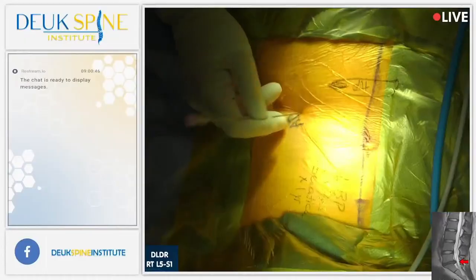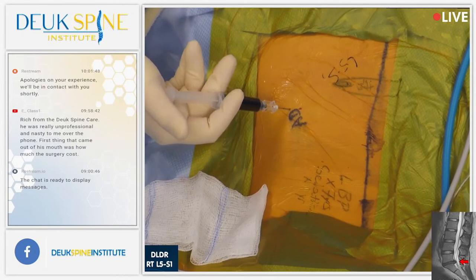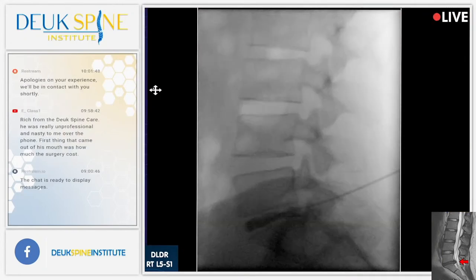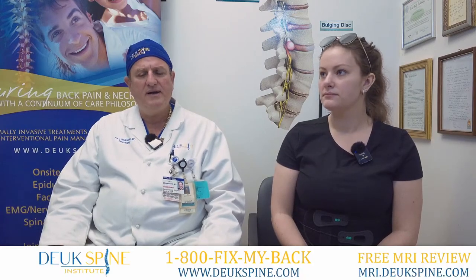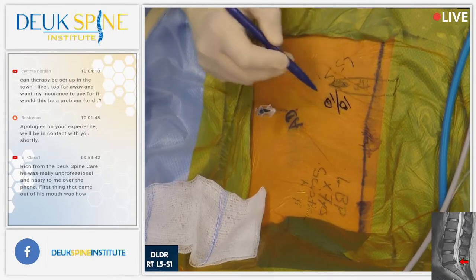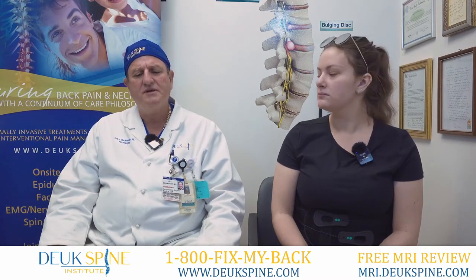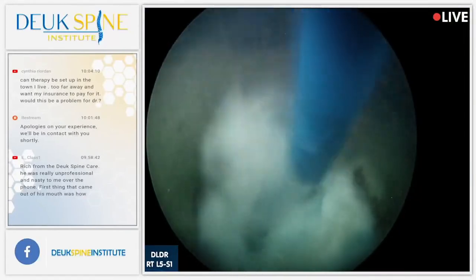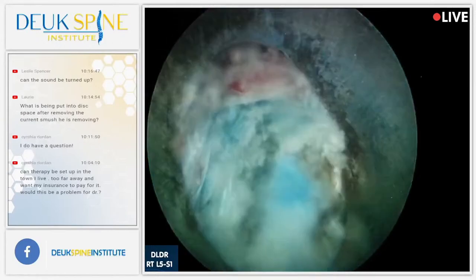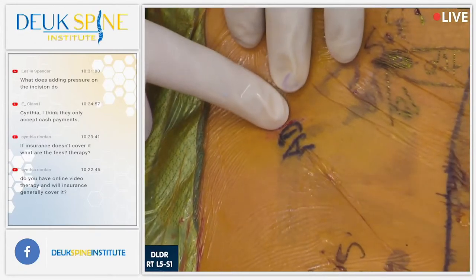So you can see in your surgery right here, we actually tested your L5-S1 disc with a discogram, which is a test done to verify that that disc is indeed causing your back pain. And when we tested it, we asked you how bad it was, and you said 10 out of 10 pain. And I said, is that your typical pain you get every day? And you said, yes, it is. So we verified the source of your pain was the L5-S1, and you can see the laser was used to clean the tear endoscopically. Your incision was only 1/4 inch, and there's no need for fusion or metal or artificial discs. This surgery replaces fusion and artificial discs.